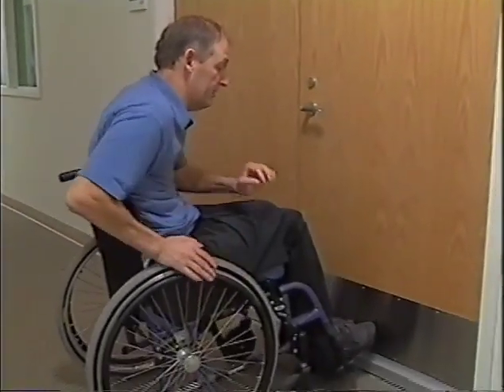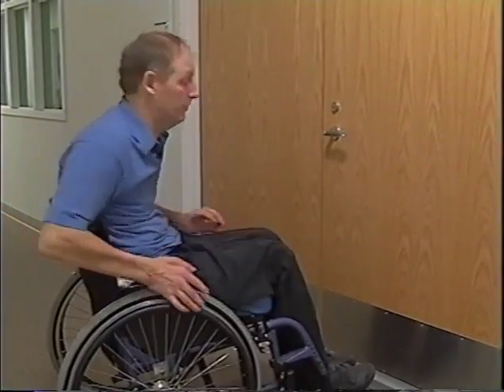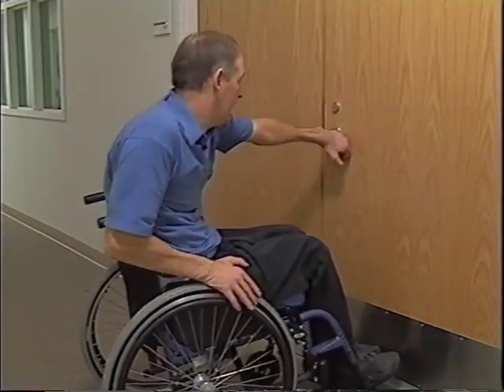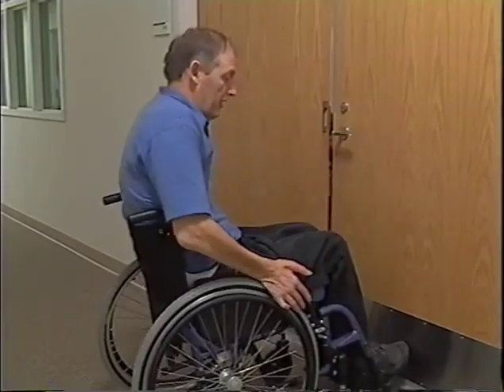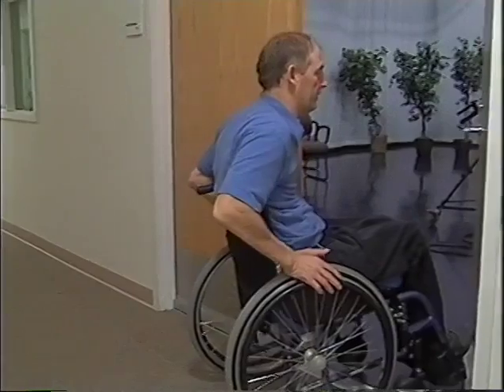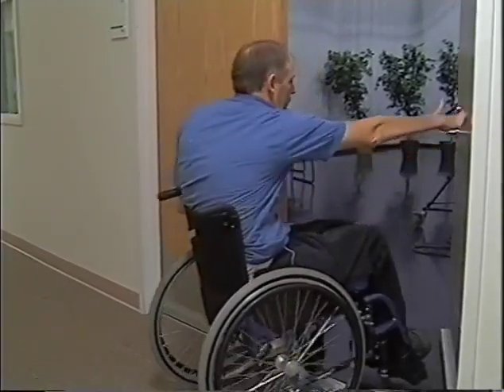When it comes time to opening doors, I want you to come up to the door and make sure it's unlocked. A lot of people have damaged their toes simply by trying to bash into the door and not losing their momentum. So make sure the door is unlocked. If you have to use the handle, get it unlocked and go back to the wheels. Try to stay with the wheels. If you start pushing on the door, you're going to find out that you're really pushing yourself backwards.